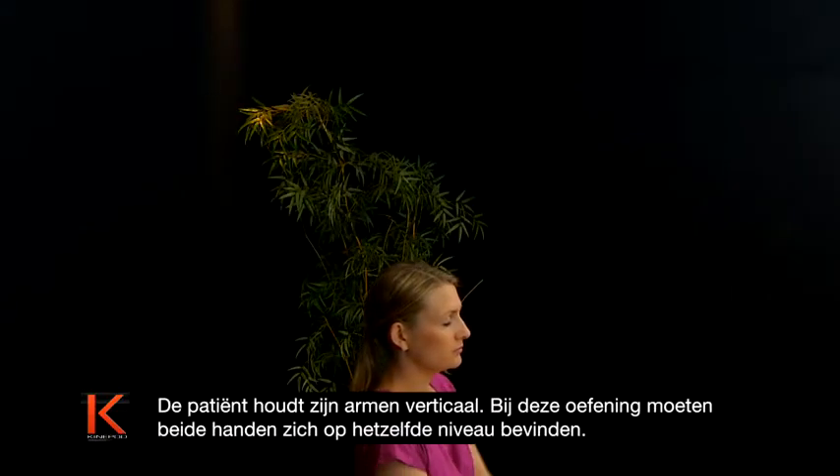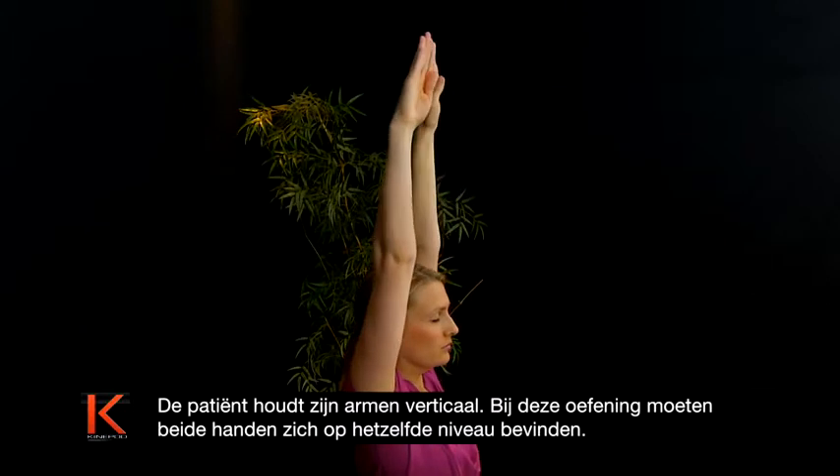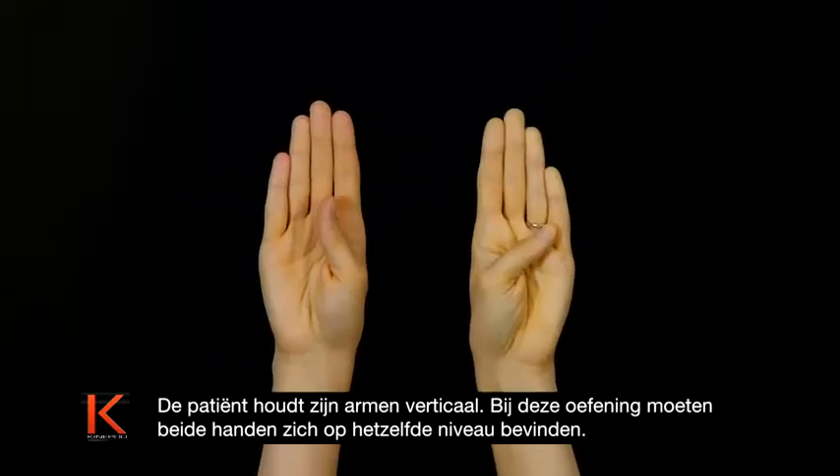The patient positions his arms upright. In this exercise, the two hands should be positioned at the same level.